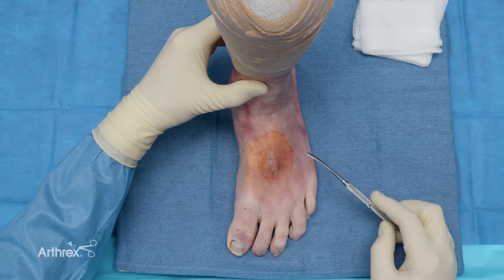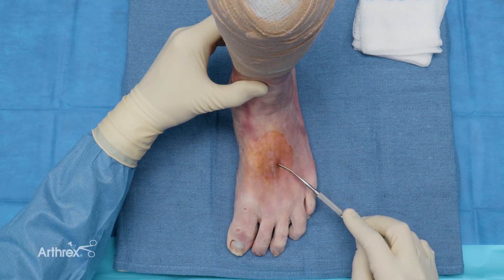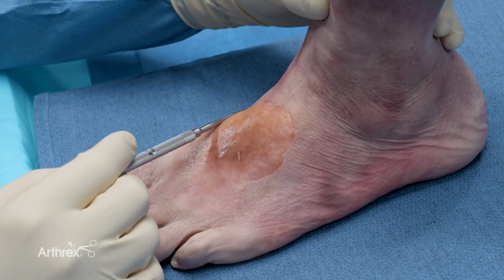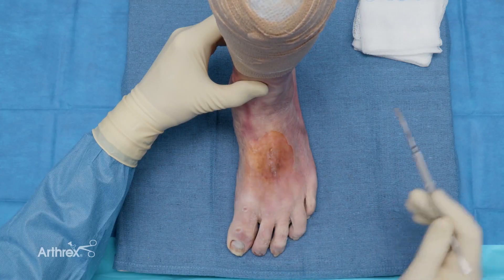After that plate is placed, you can then use the internal brace repair, again from the base of the second metatarsal to the medial cuneiform. Then once you place that portion, you can then come over the top into the middle cuneiform.